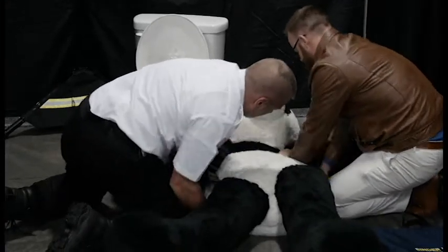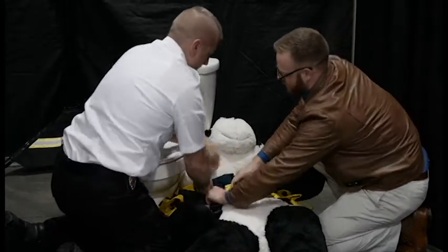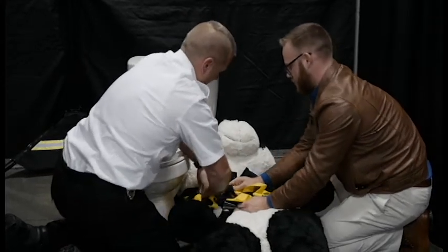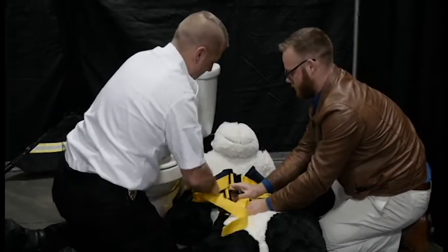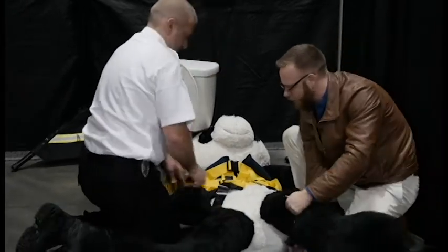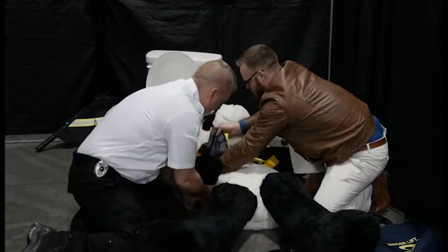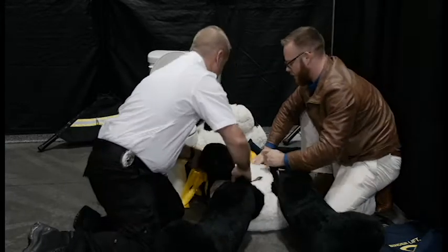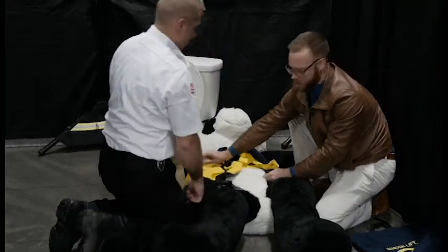Once you get it semi in place, just enough to buckle it, you're going to start buckling the Bender lift. Then you're going to grab the leg straps, come in underneath the patient's legs, and buckle them in. You do that before tightening these down.